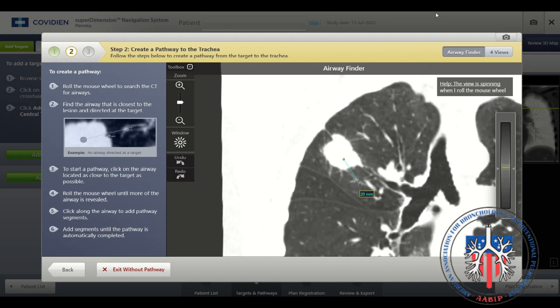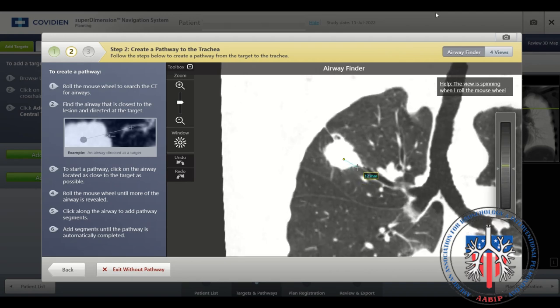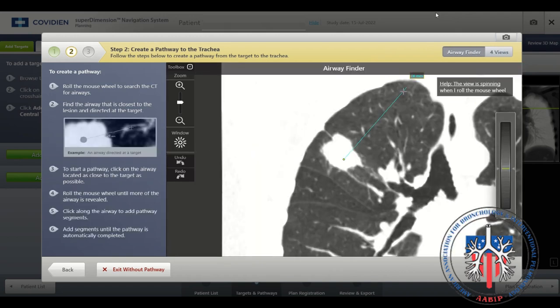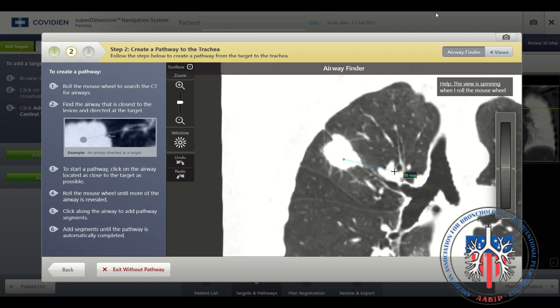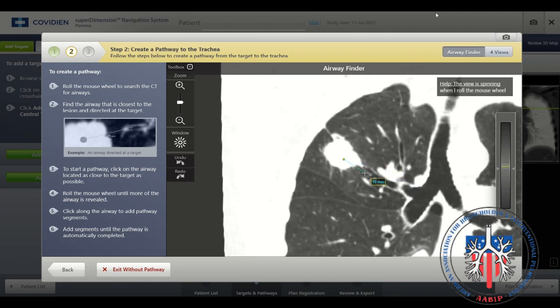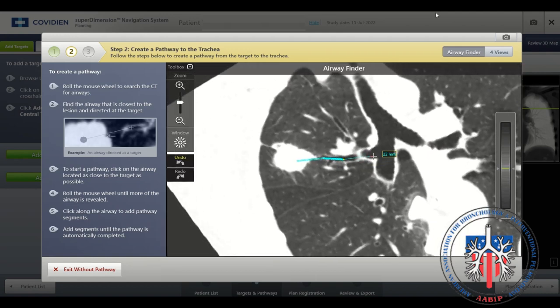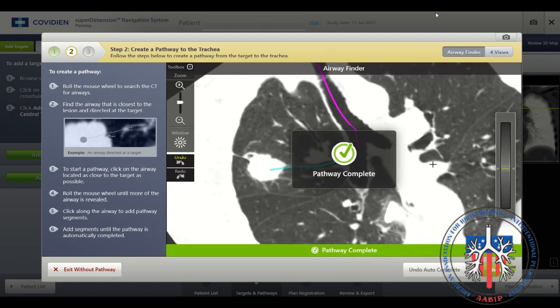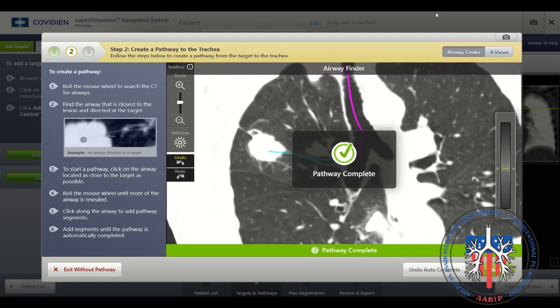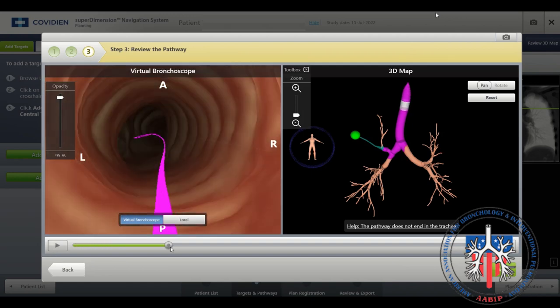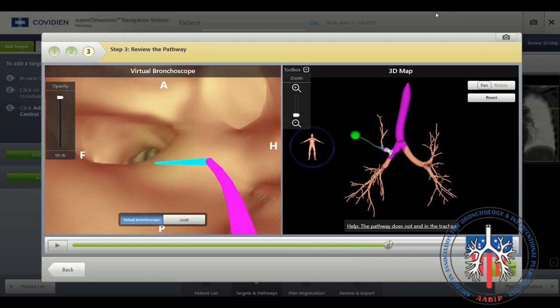You are now in the airway finder view. Scroll through the images until an airway is identified that is adjacent to or close to the nodule. You may also use the 4-view option to see multi-planar views to plan the pathway. Place the cursor in the airway. Once the cursor is placed on a virtual pathway, the pathway will be automatically created. In this example, because the posterior segment was absent on the 3D reconstruction, the pathway was not automatically created until more central airways were identified. Once the pathway is created, review the pathway.